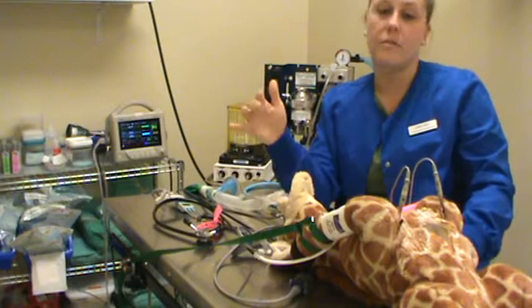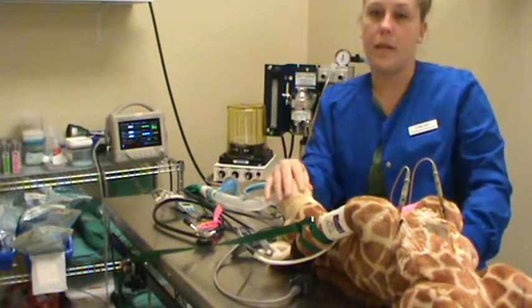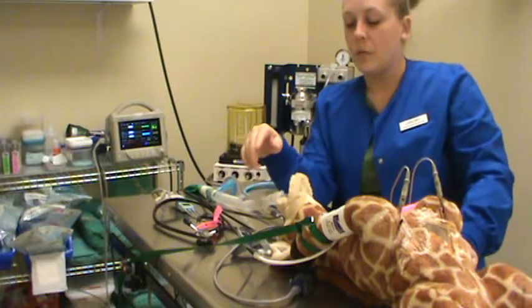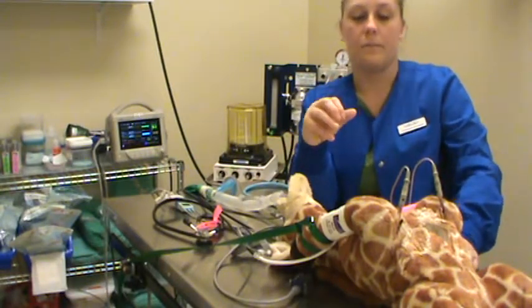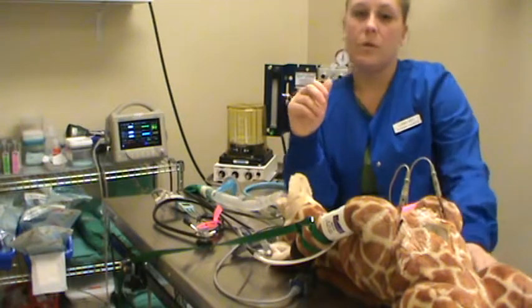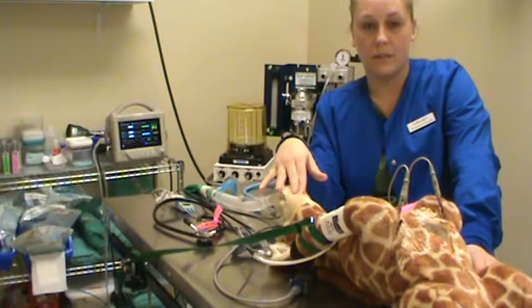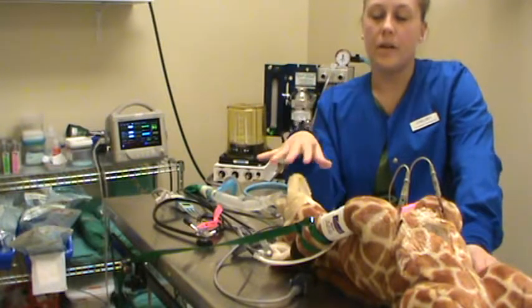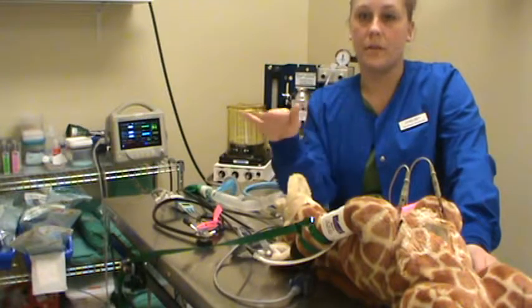One last thing we're going to go over here before we move on to that is our heart rate and rhythm and our respiratory rate and rhythm. So those are really important to monitor. The ECG leads monitor the heart rate and rhythm here. So during anesthetic, this is a giraffe, but we usually work on cats and dogs. Cats are going to have a heart rate anywhere between 120 to 140 when they're just sailing on their anesthetic.